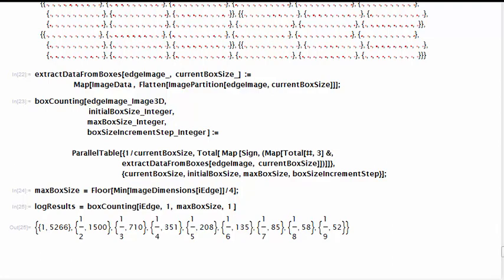We save the results of box counting in the variable log results. You can see how the number of box elements that contain part of the edge of the tumor is lower when we increase the box size.